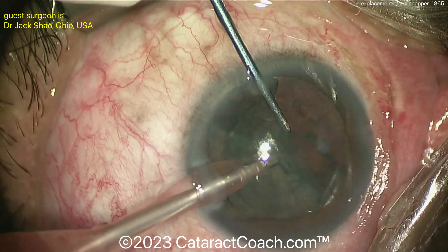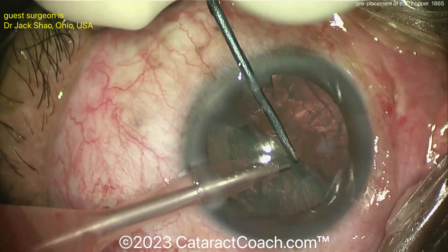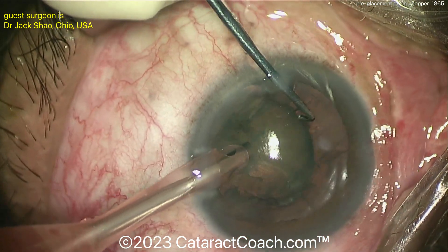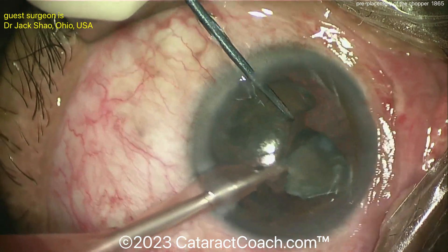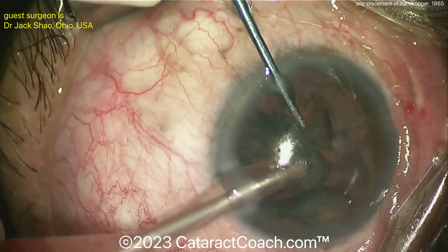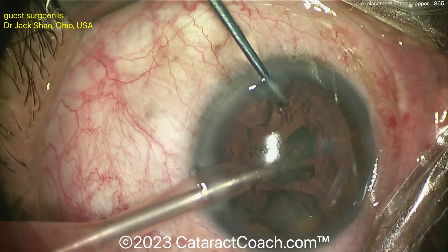So that's the idea — to pre-place the chopper before you do the chop. We'll watch this again. I'm going to show you the rest of this nucleus removal, and then we'll watch the entire nucleus removal all over again to really drive home the point. Once that's done and you have pieces like a hemi nucleus, it's very easy to break it up into smaller pieces and continue from there.